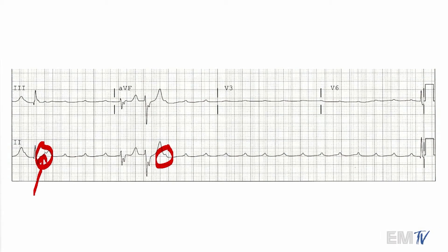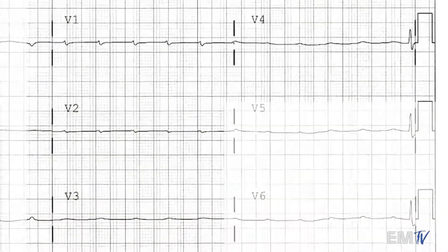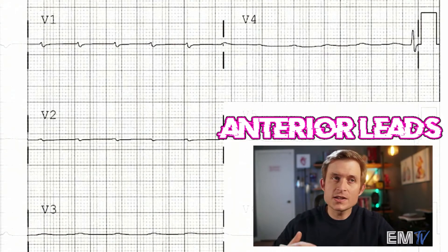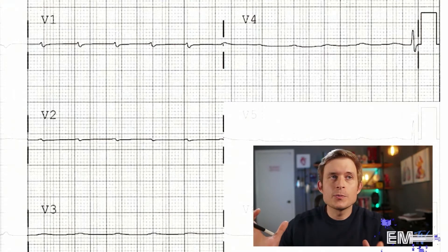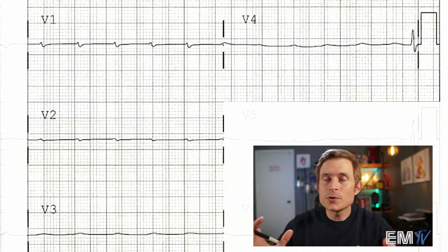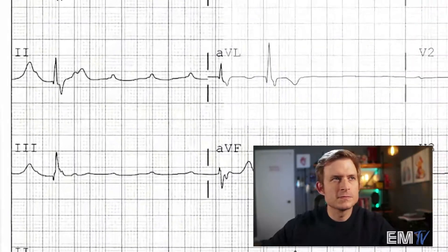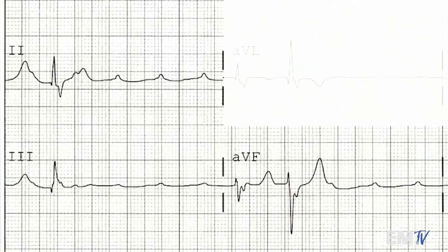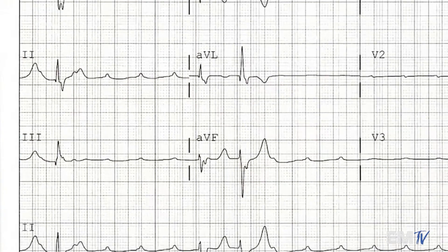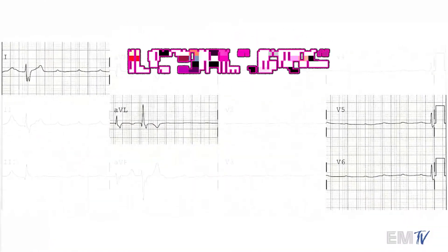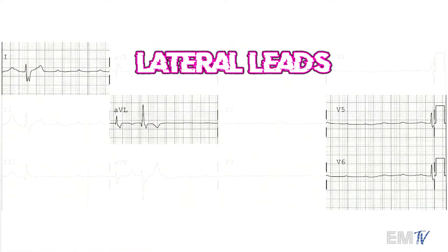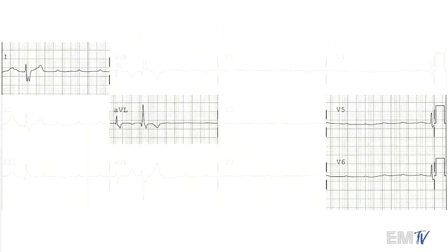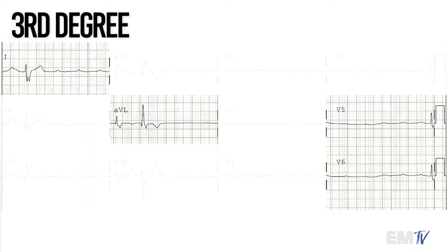3rd degree heart blocks are known for having P waves that are superimposed in QRS complexes and in T waves. Let's now examine the other lead groupings. Because this 3rd degree heart block is so slow and doesn't conduct that often, my anterior lead grouping is largely undiagnostic because all it is full of is P waves. In my inferior leads I am seeing some QRS complexes, but nothing is jumping out at me — this is still simply a 3rd degree heart block. The lateral lead groupings are similarly inconclusive, so for static cardiology purposes, I would identify this rhythm as a 3rd degree heart block.